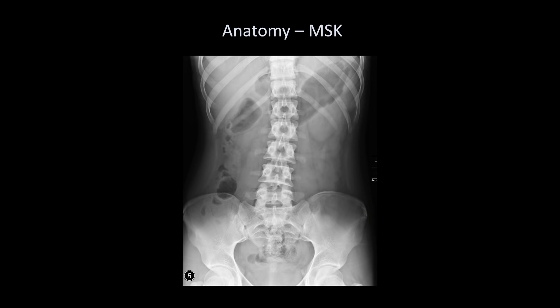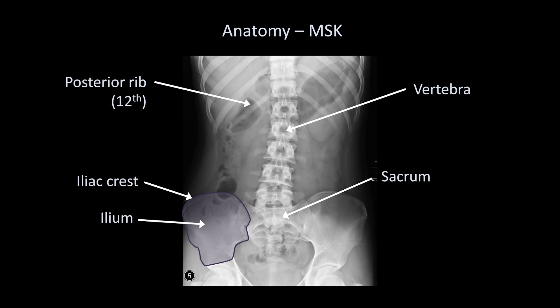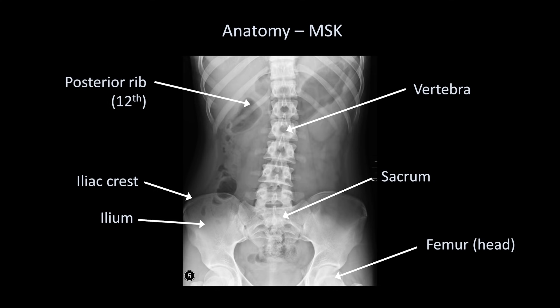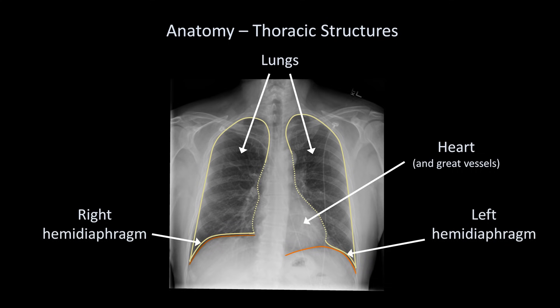Then there are musculoskeletal structures — obviously these include the ribs, with the lowest being the posterior 12th rib. The vertebrae. The sacrum. The ilium, the largest of the three pelvic bones. There is not a distinguishable demarcation between the ilium and the pubis and ischium in adults, as the three pelvic bones normally become fused. Abdominal films will usually catch the head of the femur as it articulates with the acetabulum. There is also a triangular-shaped shadow on either side of the vertebral column caused by the psoas muscle. Since upright chest films are occasionally ordered for abdominal symptoms, we also see the heart, great vessels, lungs, and hemidiaphragms.